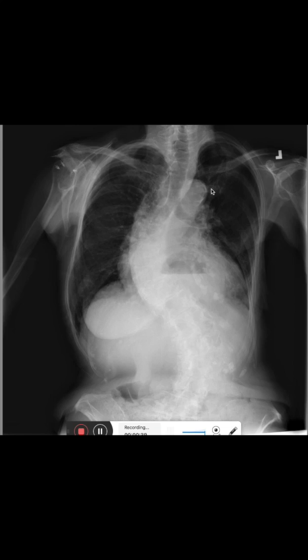What we can see is a quite pronounced scoliosis in an S shape. The thoracic spine has a right convex scoliosis and the lumbar spine has a left convex scoliosis.